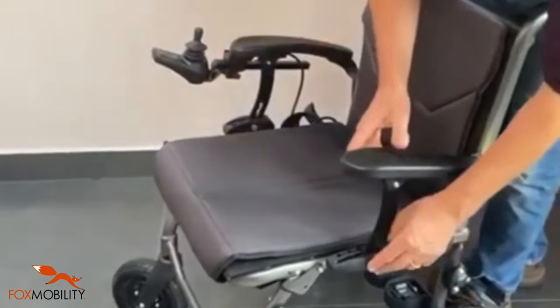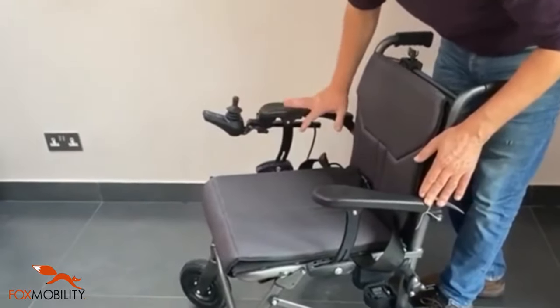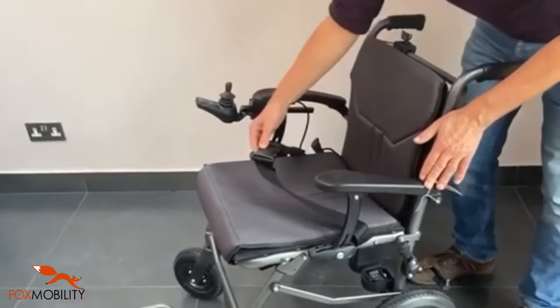You've got height adjustability in the armrests and you can move the controller from left to right very easily. It also comes with a seat belt.